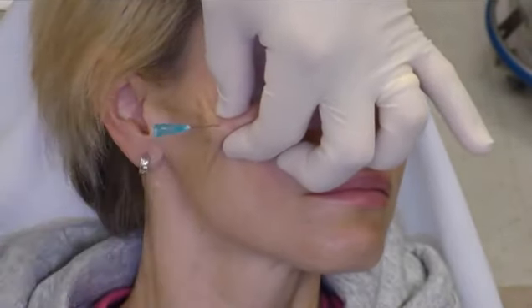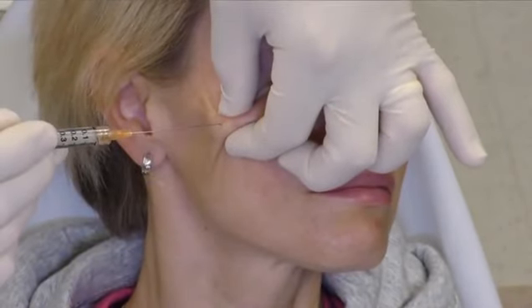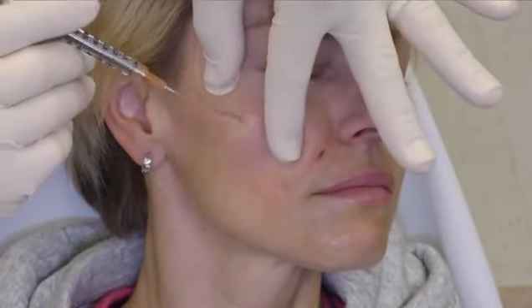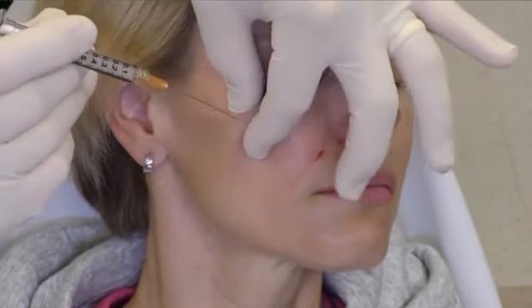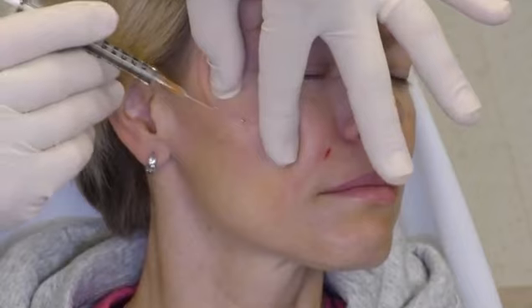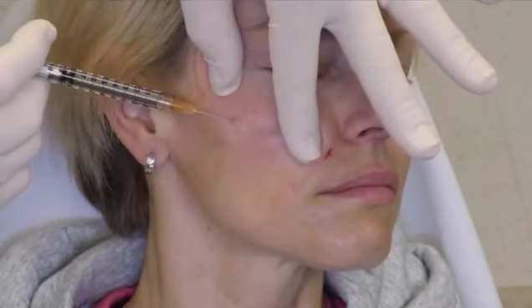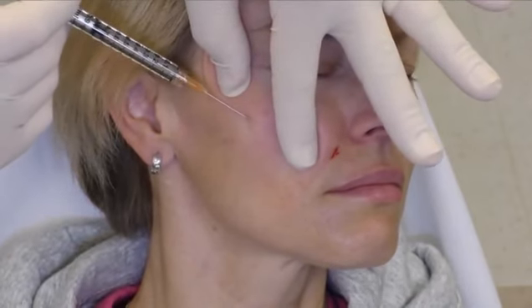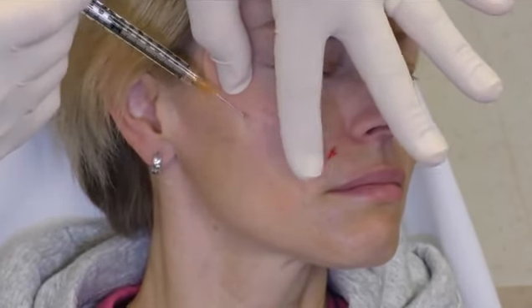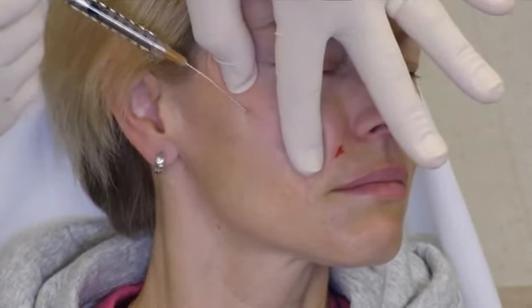In this individual who had prominent cheekbones, the aesthetic plan was to develop submalar fullness with a subcutaneous injection through the superficial middle fat pad, which is accessed through this cheek access port, which falls below the orbitomalar ligament insertion onto skin.